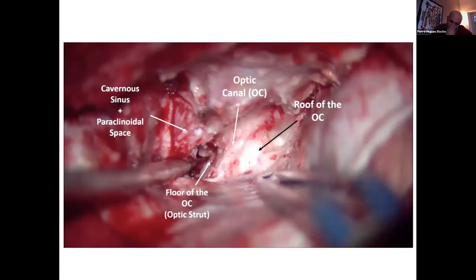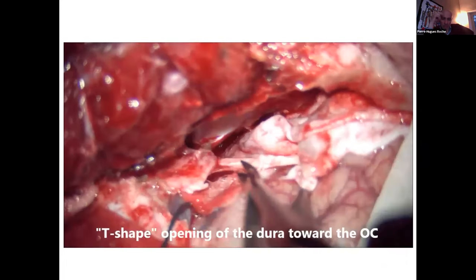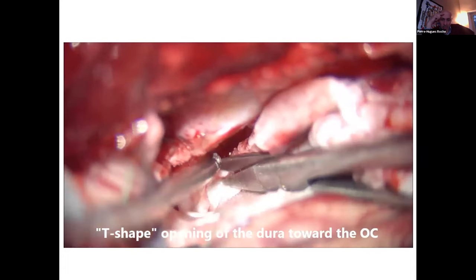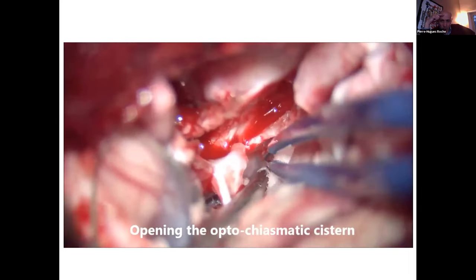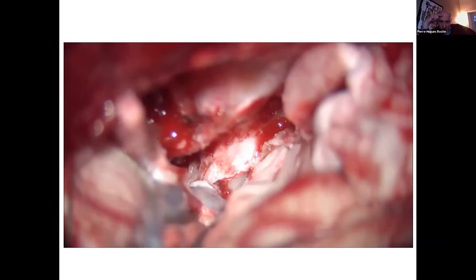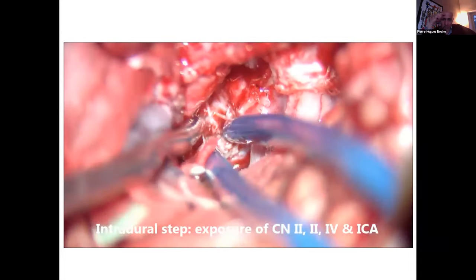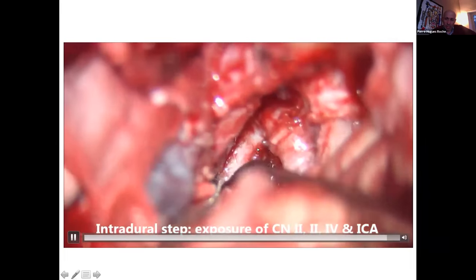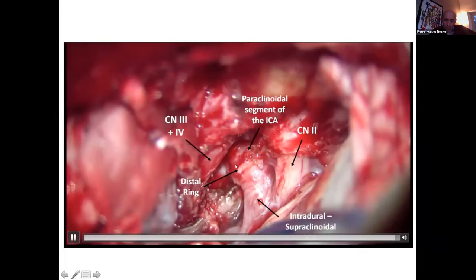And the beauty of this approach is to make the junction between the extradural and the intradural. So this cut of the dura will go all the way to the optic canal, to the falciform ligament. And you can see here, we have the junction between the extradural part and the intradural part of the optic canal. The next step is to expose the dural carotid ring. You can see here, this is the distal carotid ring, which is here. And which is interesting, this is the final view of my video, is to show the distal ring here.